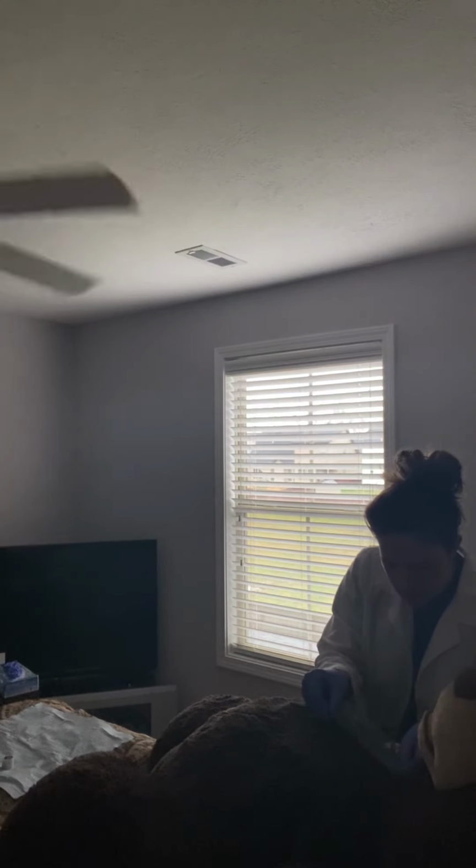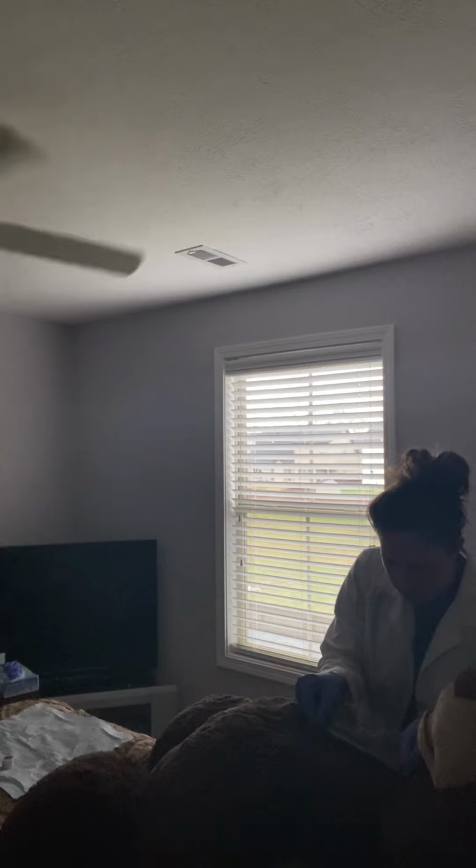We're going to stay consistent with the documentation method, whether it be inches or centimeters, of the prior nursing documentation. So we are going to use our measuring tool here. I'm going to do length, width, and then use the cotton applicator to measure the depth. We're doing centimeters here, and we're going to go from one end all the way to the other. We've got 14 centimeters in length. We've got 3 centimeters in width.